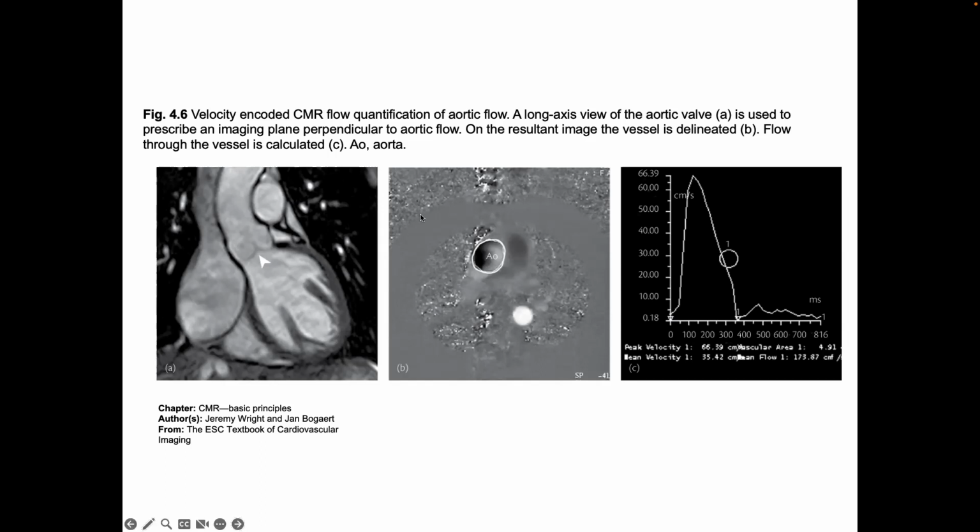You can also see in the background, so this is all zero. There's no flow here, so it's basically zero, but above your data right here, you can see all of this noise here. That noise is essentially from the inconsistency from beat to beat of this flow data. Those inconsistencies are things that, as you're encoding from one phase encode pulse to the next, you have just a noise term, which is an inconsistency. And that shows up as basically a noise stripe in the phase encoding direction. Right?